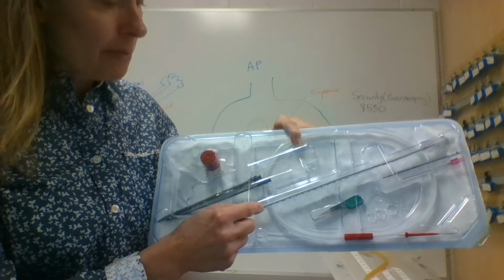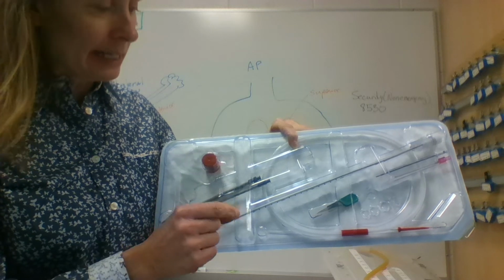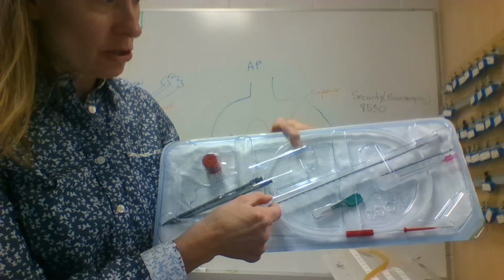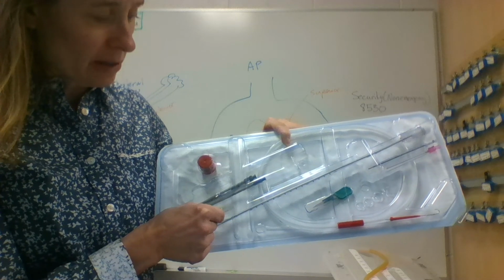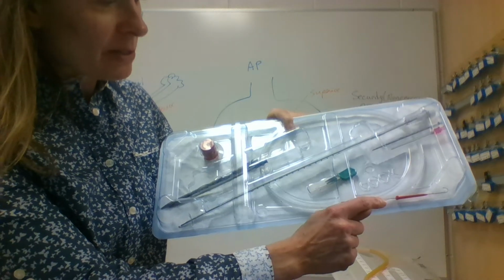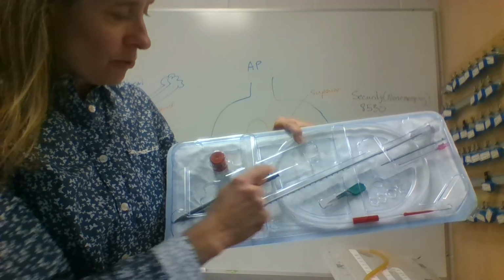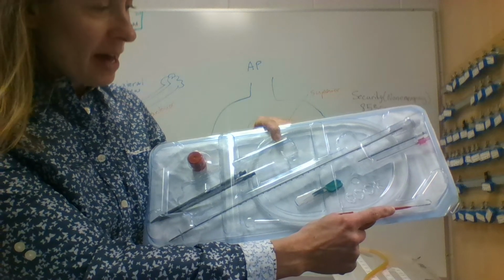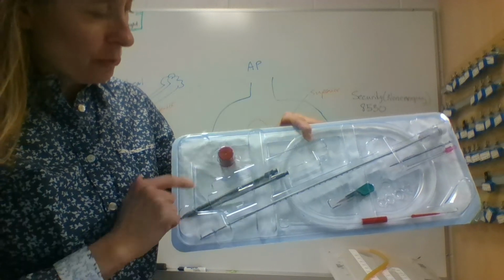So once the radiologist feels as though they have dilated that little cut they have made in the thoracic cavity, then they're going to insert this tube or this needle itself. It's a tube that has, I can't remember the exact name of it, and I should look, but anyways, what they want to do is place this in the correct location. So once the final dilator is used, they're going to take the guide wire and thread the guide wire through the dilator.